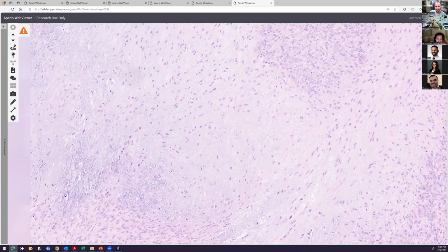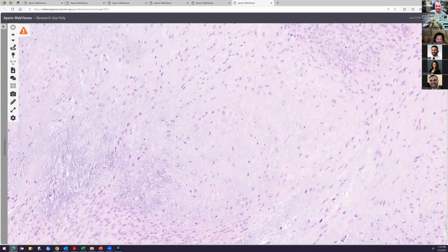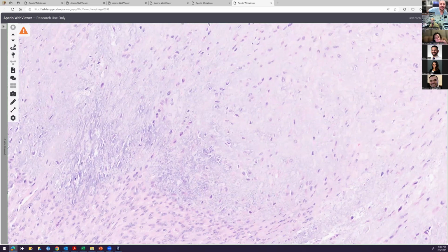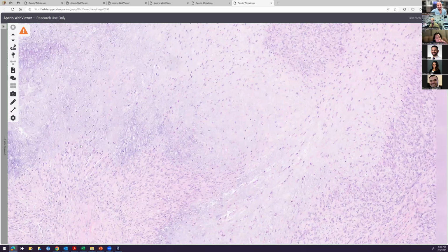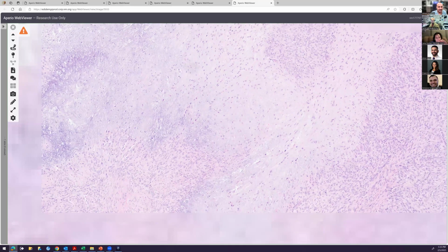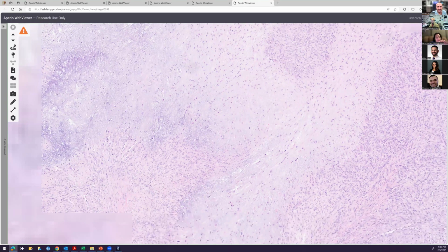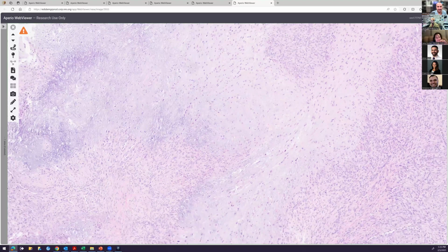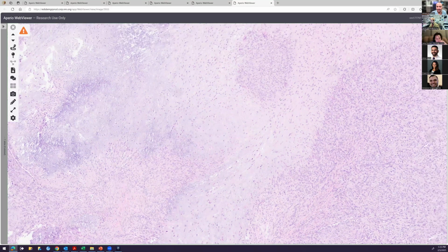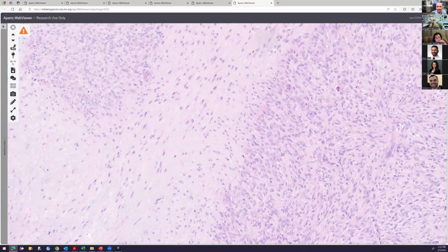That's true. Okay. What else are you seeing? What is this stuff? Maybe calcium. Yeah, there are calcifications as well, right? So this is a bland, spindled, hypercellular lesion with a calcifying matrix in the center. That happens. On the edge of that you get somewhat epithelioid palisading cells around this, and then giant cells as well. What do you guys think this could be?